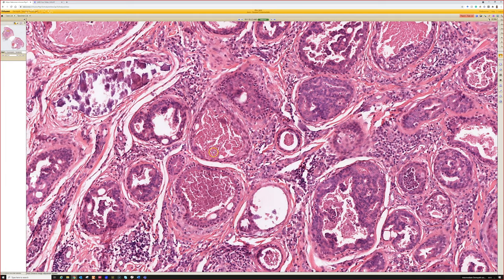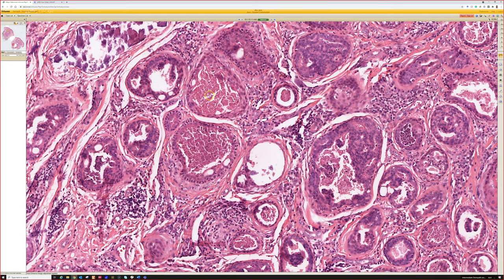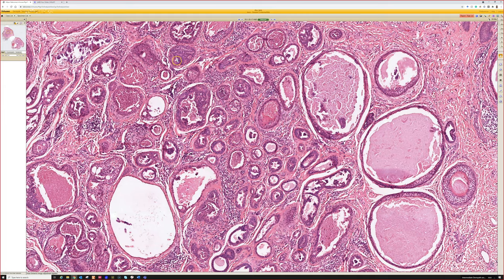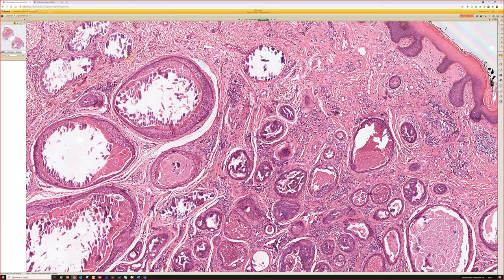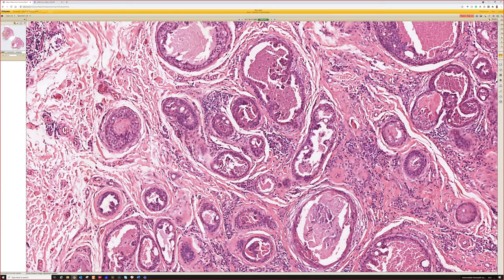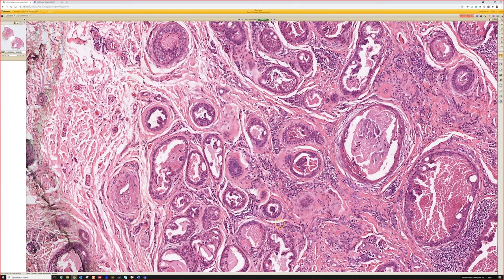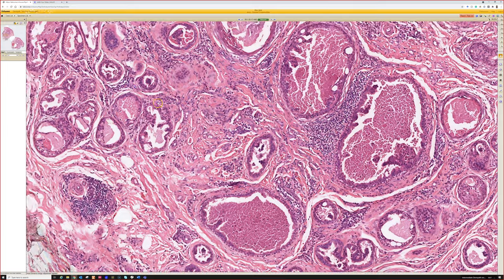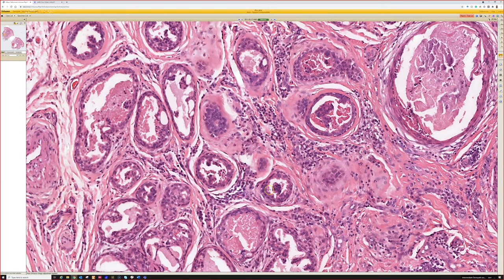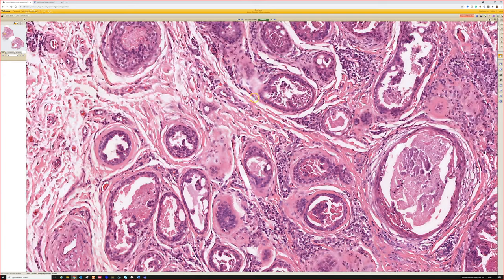They can have some debris. It looks almost like necrosis, but I think it's just debris from broken down sweat duct cells in the lumens. You can have calcifications with it, like we saw up here. And then some of the cells will have apocrine snouting. So if you see apocrine snouting, then you can say, oh, okay, it's a tubular apocrine adenoma. For a test, that's what I would tell you to do: if you see apocrine snouts, then call it a tubular apocrine adenoma.